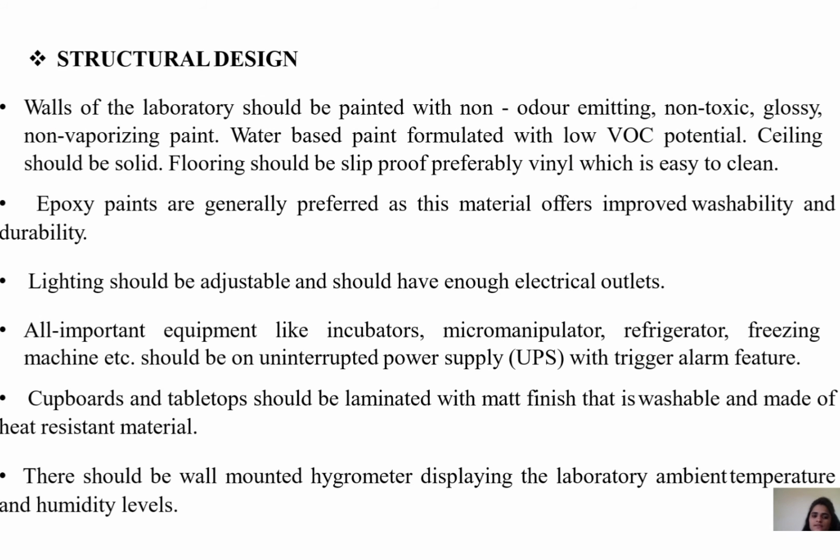The structural design. Walls of the laboratory should be painted with non-odor emitting, glossy, non-vaporizing paint. There should be no odor, no toxicity. Water-based paint formulated with low VOC potential. Ceiling should be solid. Floor should be slip-proof, preferably vinyl, which is easy to clean. Epoxy paints are generally preferred as this material offers improved washability and durability. Lighting should be adjustable and should have enough electrical outlets.